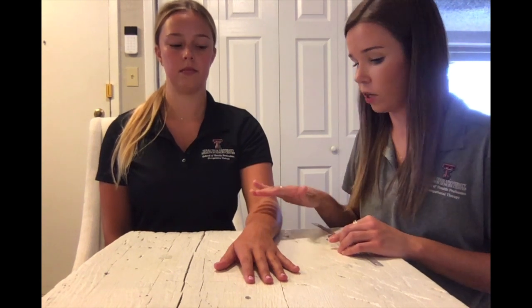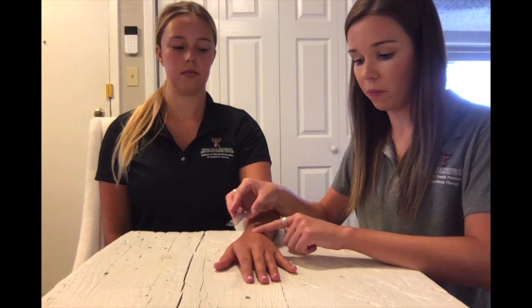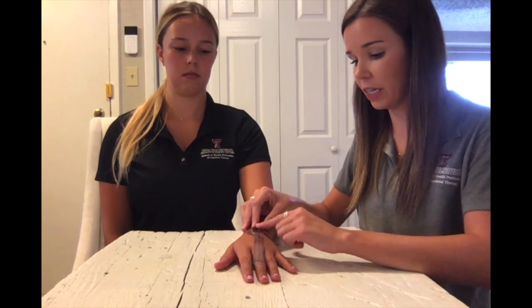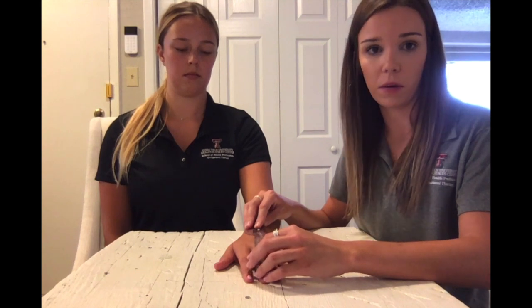To measure both wrist ulnar and radial deviation, your client will be positioned seated in a chair at the table. The forearm will be placed flat on the table with the forearm pronated. The axis of the goniometer will be placed on the dorsum of the wrist at the base of the third metacarpal, where you should be able to palpate a hollow space over the capitate bone. The stationary arm is going to remain parallel with the forearm and the moving arm parallel with the third metacarpal.